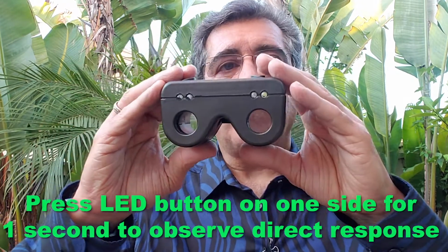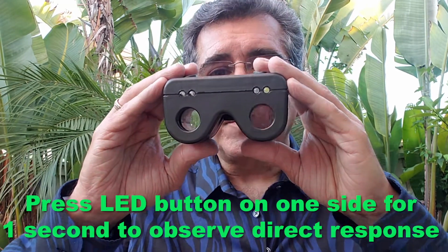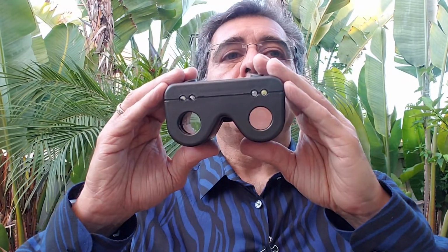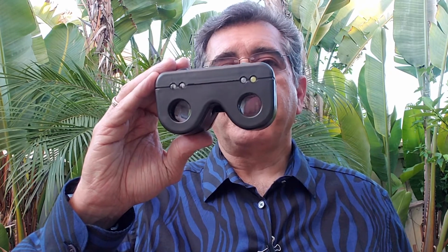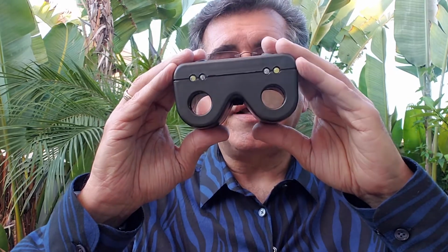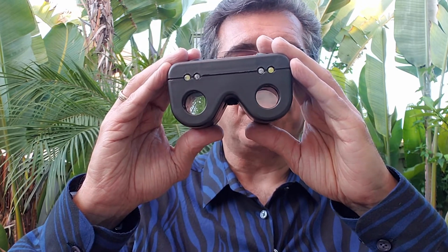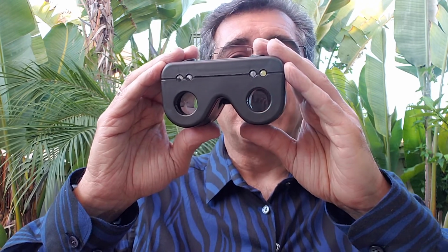Press the button for one of the LED lights and observe the direct response. Leave it on for about a second and then turn it off. You will see the pupil constrict, and then as you let go, the pupil returns back to its state that it was before.